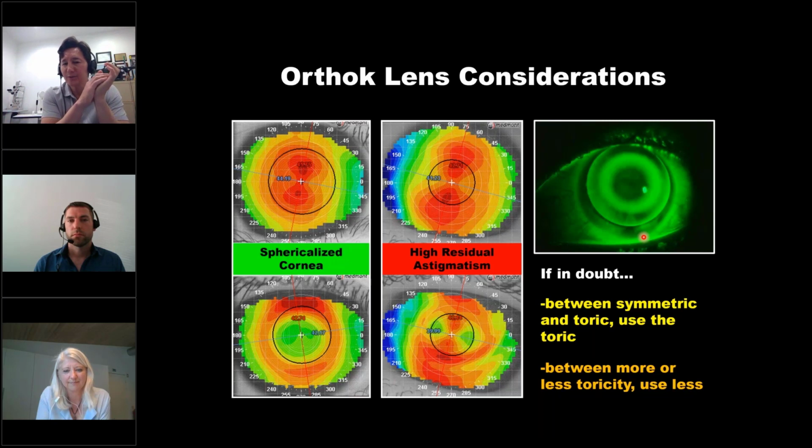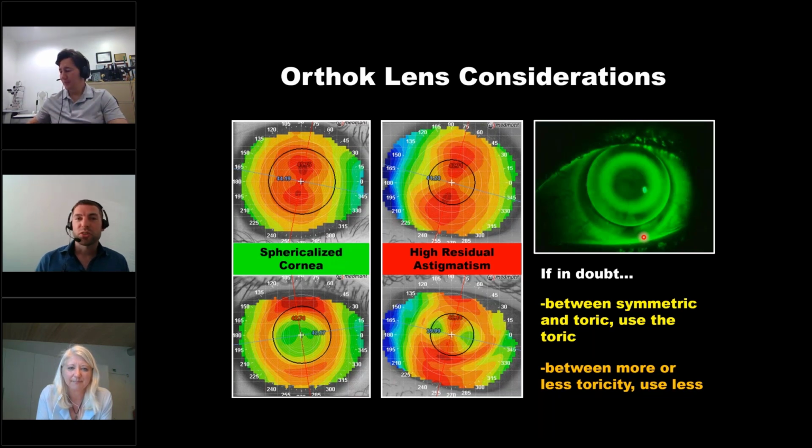Mette, your highest corneal or refractive astigmatism that you've been able to fit in Ortho-K? Just give us an anecdotal one, one patient was as high as? I think we are maybe around 4 diopters of astigmatism. Wow, that's awesome. That's an amazing amount. Nikki, in your findings? I'm not a full-time fitter, so I personally don't fit a lot of lenses myself.